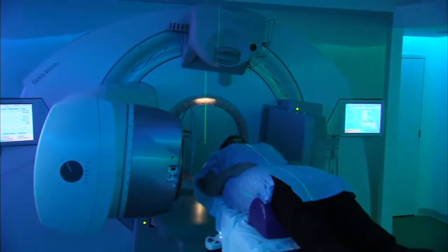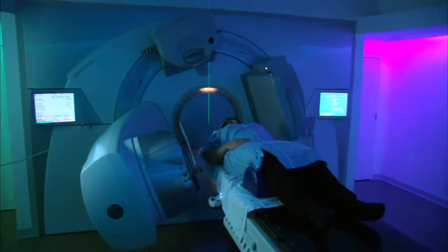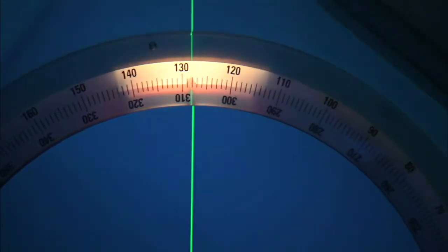The actual time the beam is on, delivering radiation, adds up to less than a few minutes. However, you may be in the treatment room anywhere from 10 to 40 minutes, depending on the complexity of your treatment and preparation. So we've got image-guided radiation therapy.